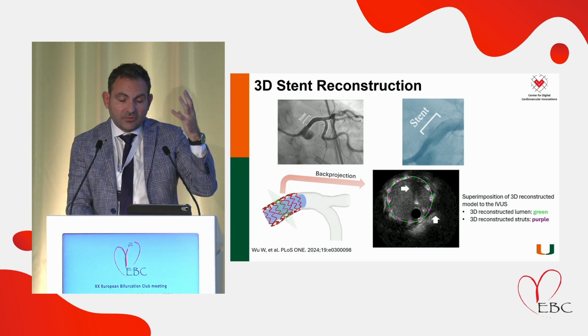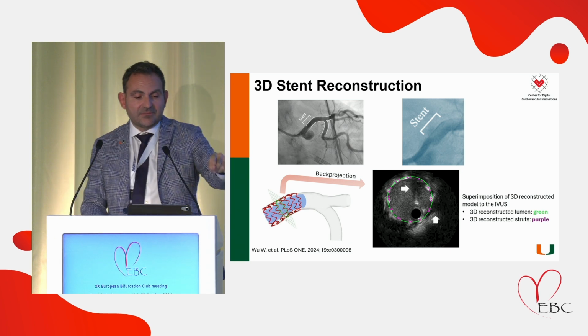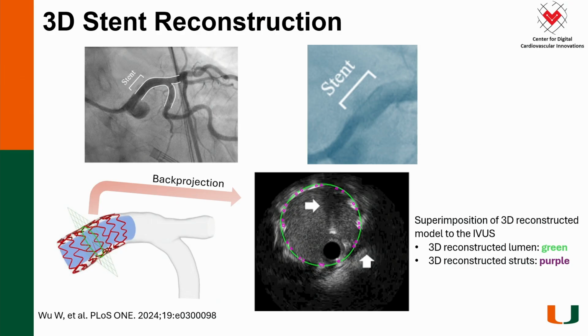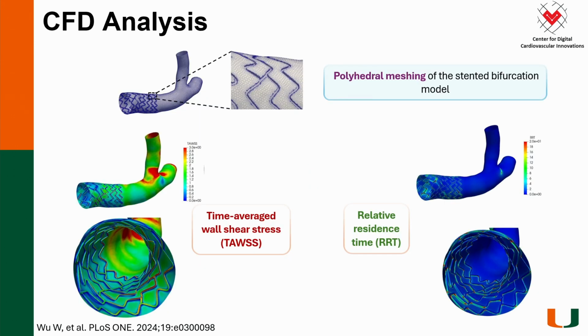And for those who don't believe if this is accurate, now we take this model on the left and back project it to the actual IVUS. And you see here nearly perfect alignment of the stent struts of the 3D model to the actual IVUS images. And of course, this can give us the opportunity now to run patient-specific CFD analysis.